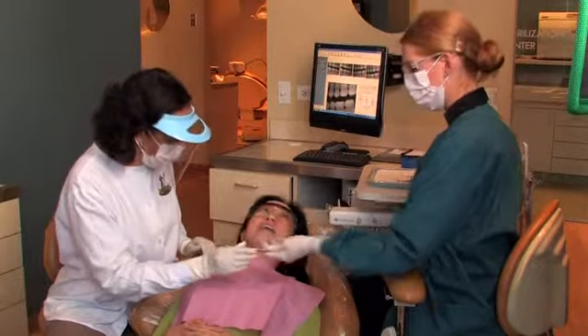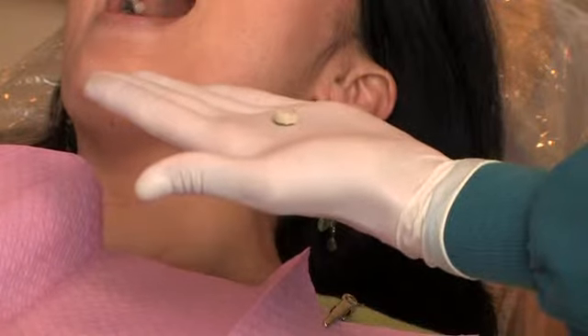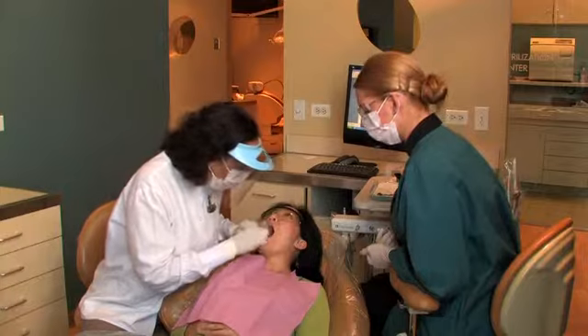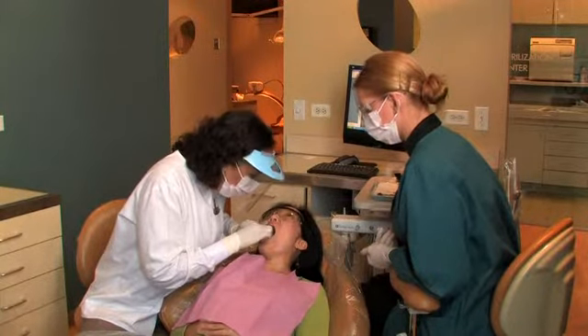Your dentist strives to make the crown as natural looking and comfortable as possible. When making a crown, the materials may be colored to match the shade of your natural teeth. Also, a crown will fit your natural bite and be the same length and shape as your natural teeth.